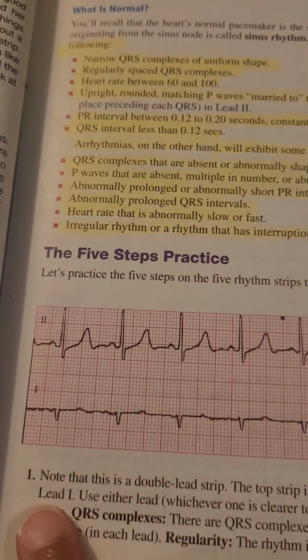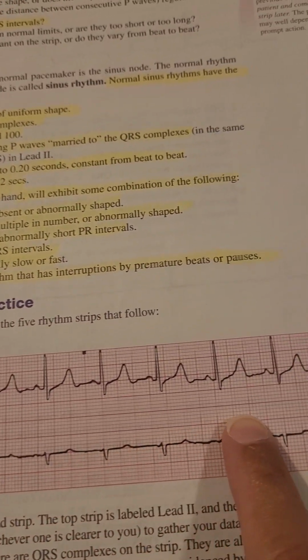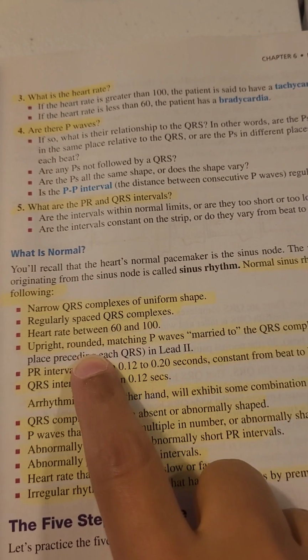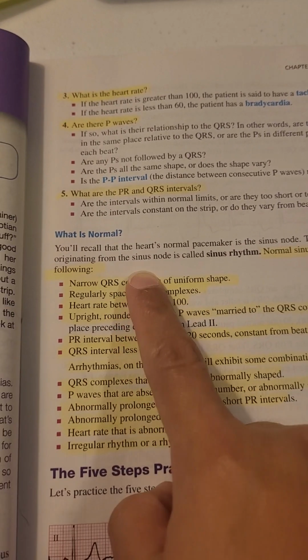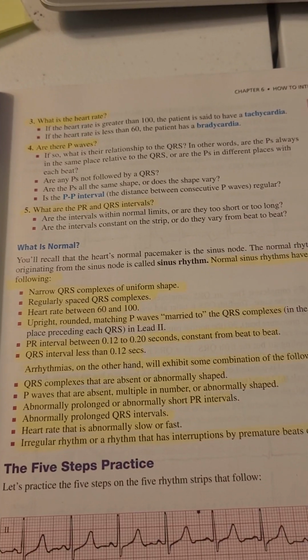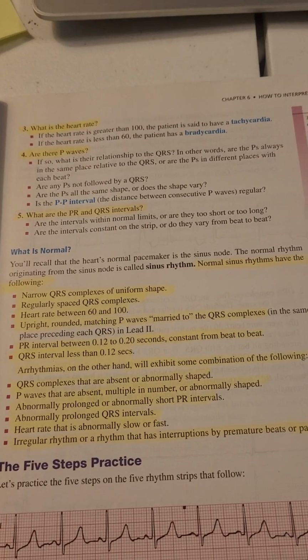So this whole rhythm right here is normal. It followed all these little rules for it to be normal. And we'll get into some harder rhythms later. But that's it for chapter 6.